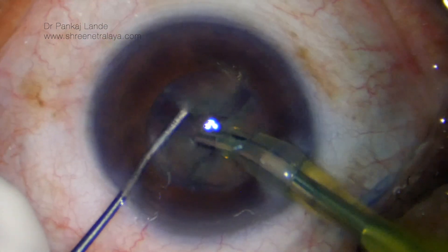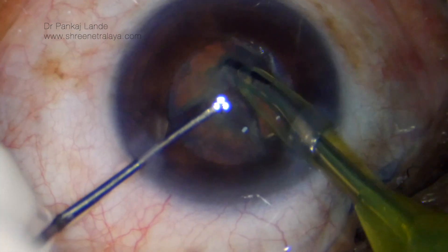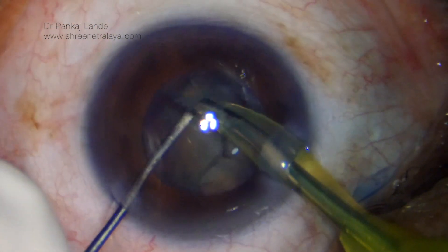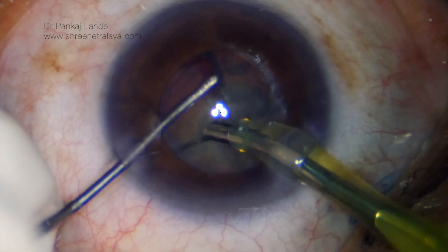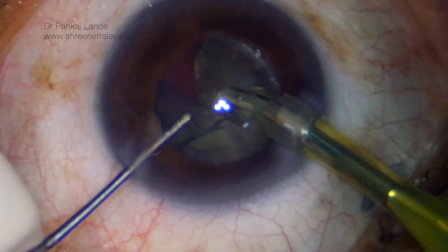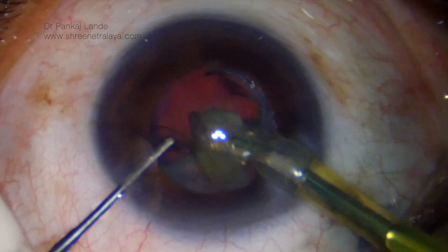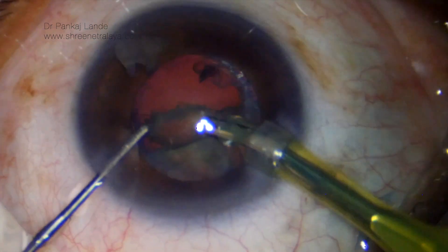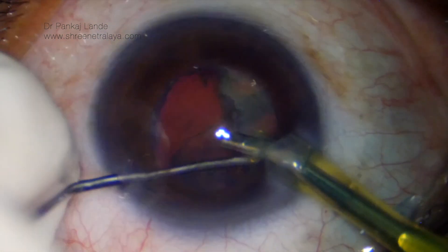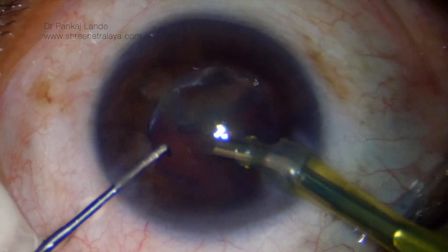Now dividing those two halves into further two. Each nuclear piece is then subdivided into further two pieces and emulsified. Note that the phaco probe tip is remaining in the center where the depth is maximum and the chances for posterior capsule rupture and endothelial damage are minimum.